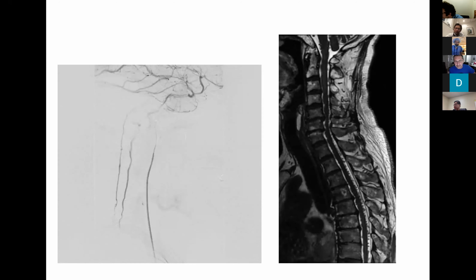Well, the problem is that if you miss it, it has significant consequences. So this is a fantastic reminder of the importance of it: you didn't find it, and yes, the chances are small, but you just have to go on and do injections of the externals and the cranial circulation, because if you don't check, you're not going to find it. Thank you. Exactly.